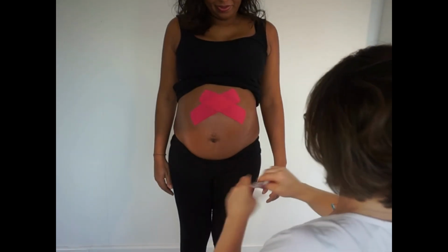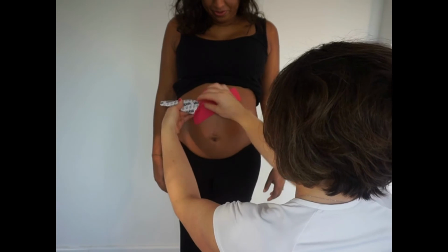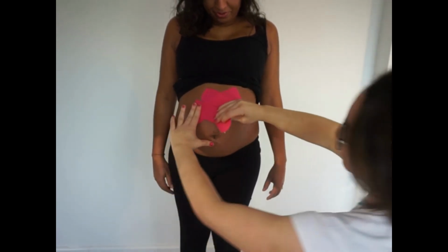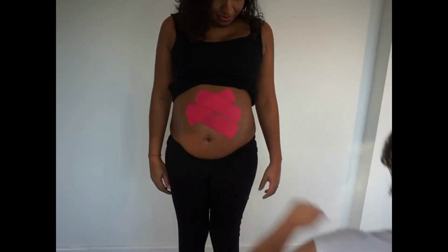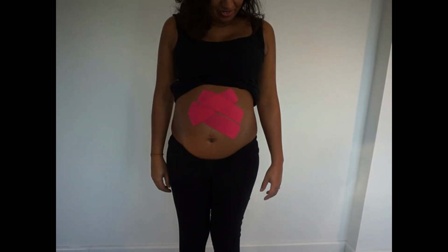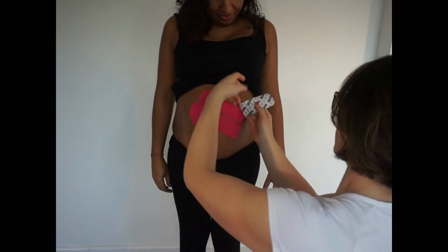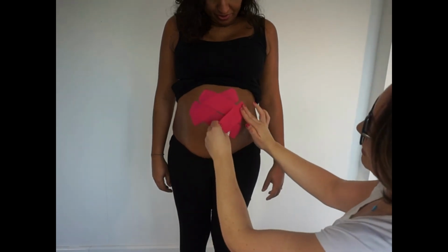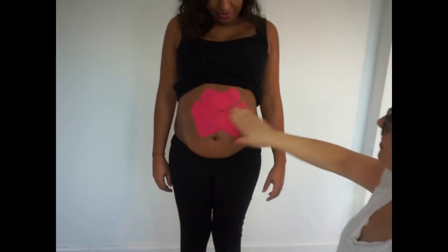And this can be repeated or done simply at the widest part of the diastasis, for example, if it's only just above umbilicus or just below, or if it's wider or from top to bottom, you might want to repeat this down the whole length of the linea alba. But again, although it's mechanical, we only want to add a light to medium amount of stretch on the tissue. And the real indicator here is if it feels comfortable to your client. So anchor with no tension, client hug the baby, light to medium stretch, and cross the midline, rubbing well to stick.